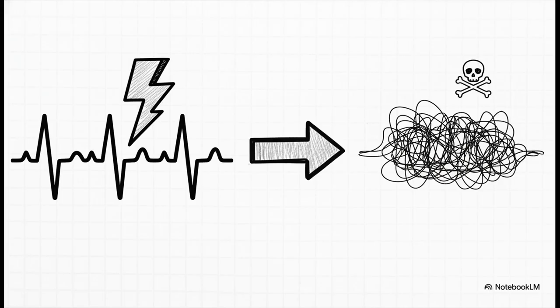So why does this synchronization thing matter so much? Why are we so obsessed with it? Because if you deliver an unsynchronized shock to a patient who has a pulse, you run the risk of delivering that electricity at the worst possible time, right on the T wave. And that isn't just an incorrect answer on an exam, it's a catastrophic, life-ending clinical error.